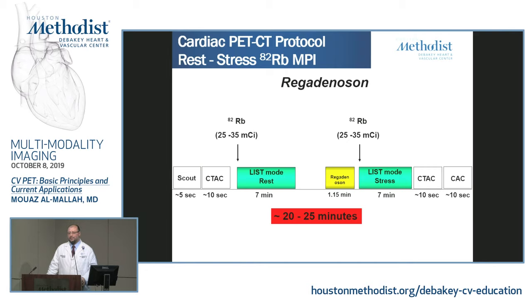The patient goes home. He has no residual radioactivity, 20 minutes on the table, 25 minutes. So now we are able to achieve a table time of almost 30 minutes. So it's very quick compared to what you have been going through with SPECT imaging. But the cost is much higher, obviously, for this one.